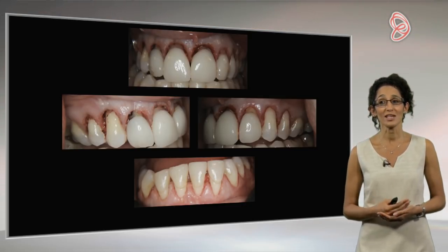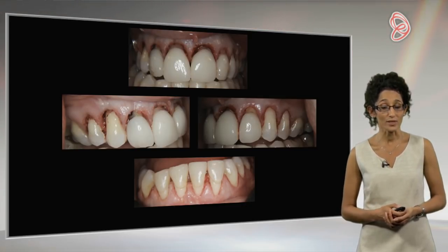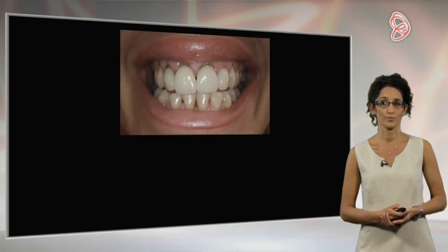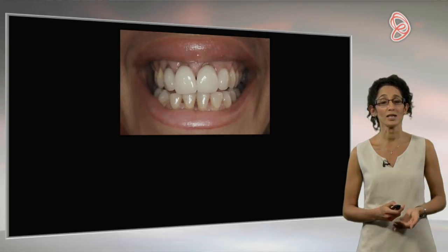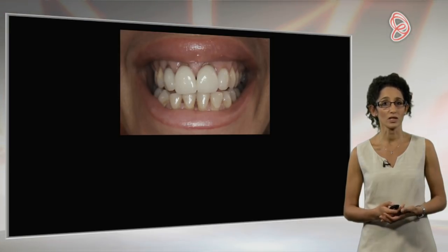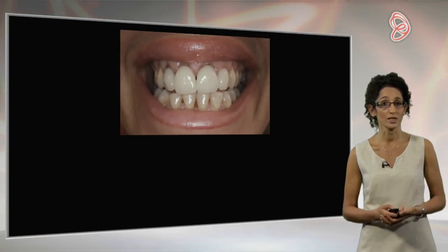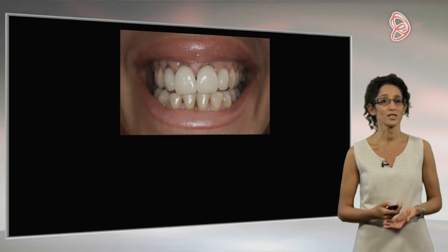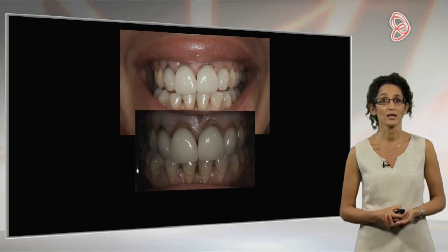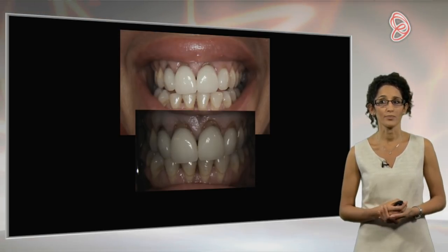And then you can see in the lower slide how we've reshaped the lowers as well. So the same thing, gingivectomy and flapless bone removal. So this is her healing a week later. So you can see the tissues heal up really, really nicely, which again is one of the advantages we find with using lasers, that we do get this accelerated healing. And usually the patients have very little post-operative pain or swelling either.